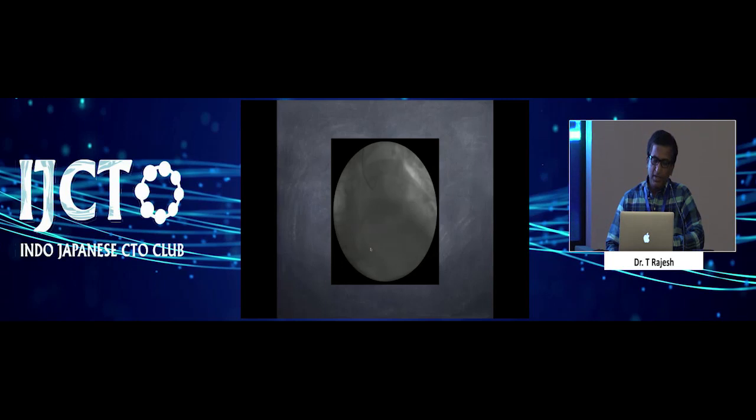This is a picture. You can see the LAD is flush occluded from the left main, hardly any antegrade filling at all. Total occlusion, no track seen antegradely. And see the RCA also, there's no collateralization from the RCA to the left. So here is a situation where you have a complete occlusion of the LAD.